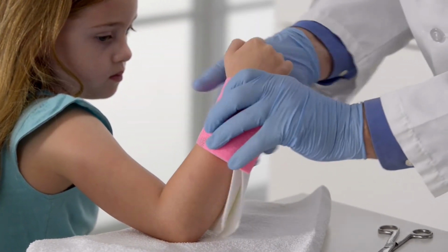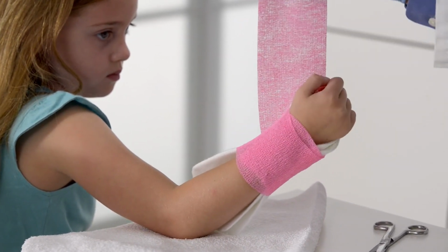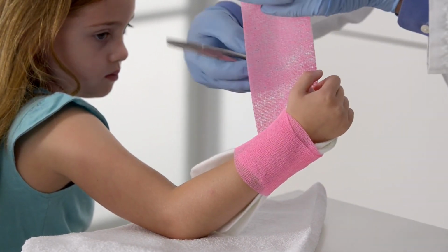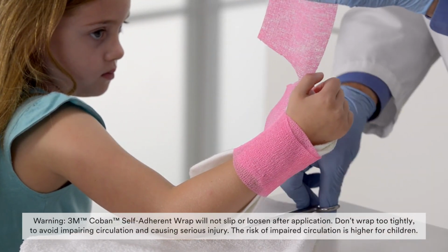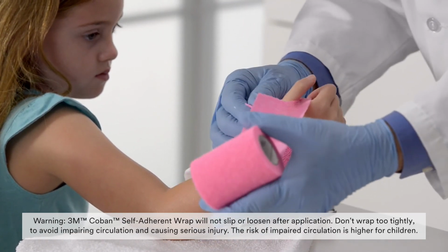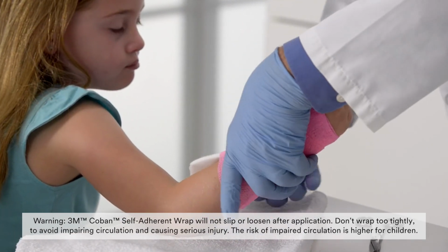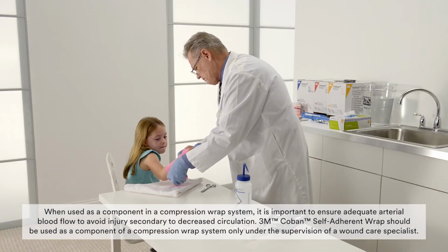Now start overwrapping the splint using 3M Coban self-adherent wrap. Alternatives could be bias cut stockinette or an ACE elastic bandage. Begin wrapping at the wrist, working up toward the distal palmar crease. Then, wrap proximally, overlapping each rotation by 50%.